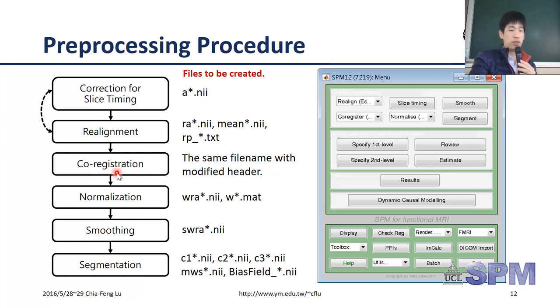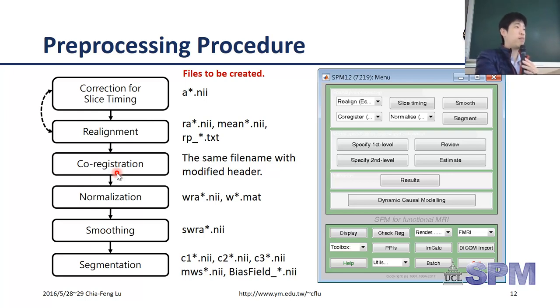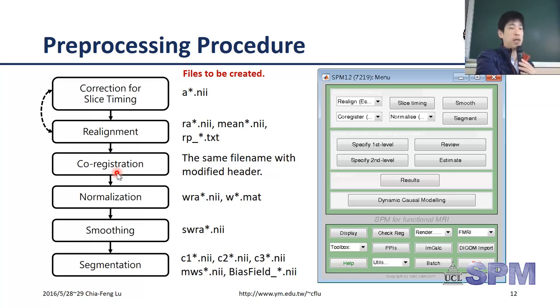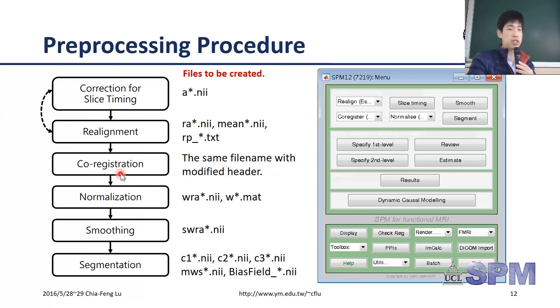The third step is co-registration. We have at least two datasets: one is the fMRI EPI dataset with low spatial resolution but with BOLD information, and another is a high-resolution anatomical image. We co-register the high-resolution anatomical image to the EPI image so we have not only the functional information but also the corresponding structural information.